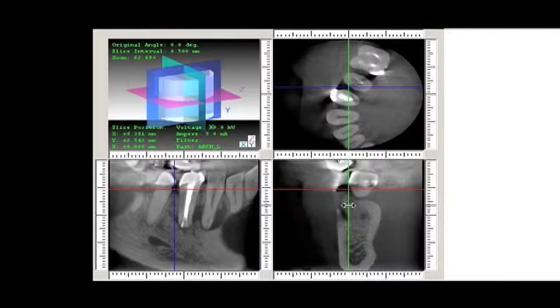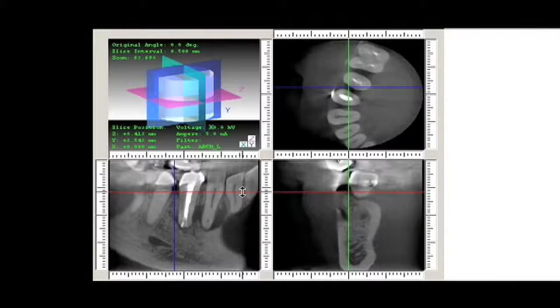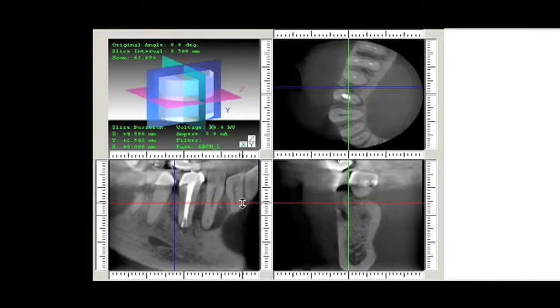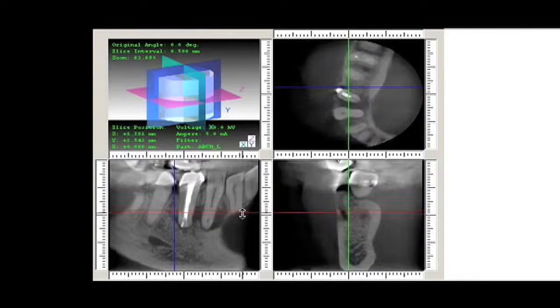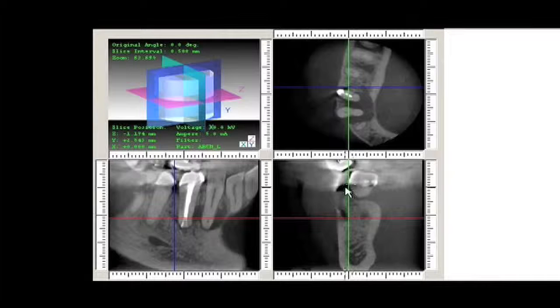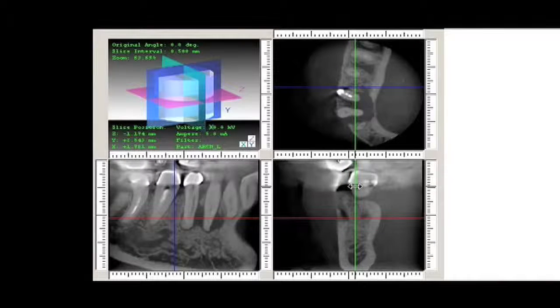In this second CBCT we are looking at the mandibular premolar area. Movement of the vertical green bar produces a series of images traveling through the buccolingual plane. We can more clearly see the periapical bone loss associated with the first bicuspid, but careful observation of the second bicuspid shows what appears to be a second undiscovered canal.